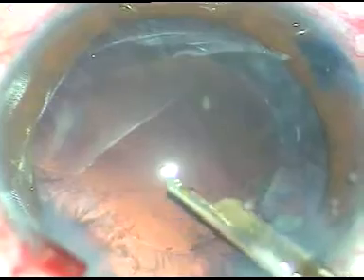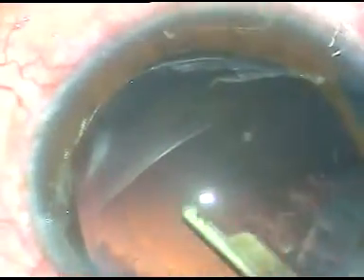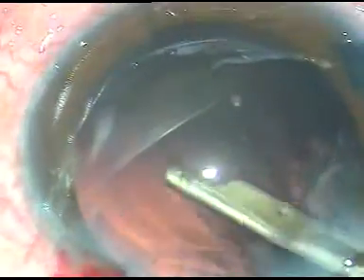This is a 23 gauge direct Simcoe cannula. This is a very simple instrument, but it is very useful. Just remove all this superficial cortical matter. This is a very thin 23 gauge Simcoe and it goes through the side port very easily.